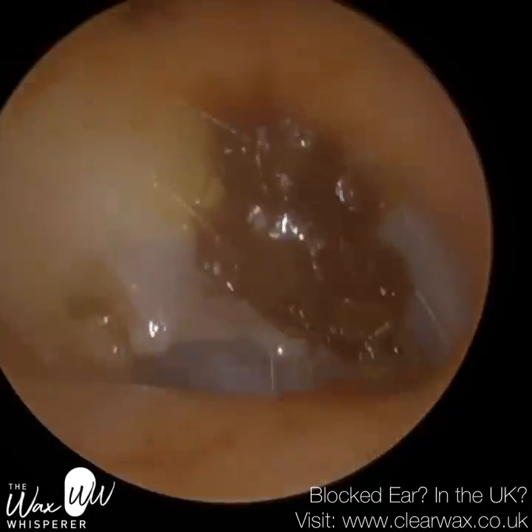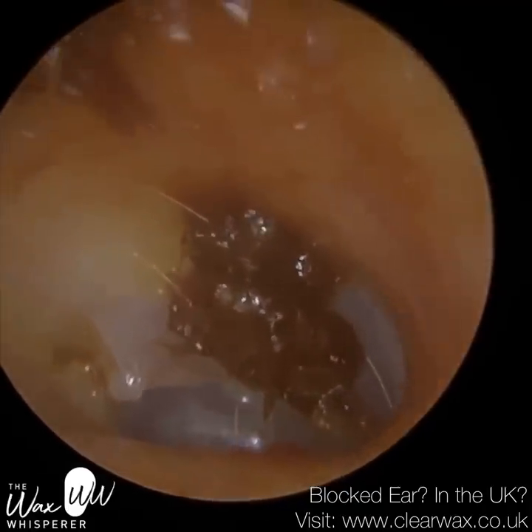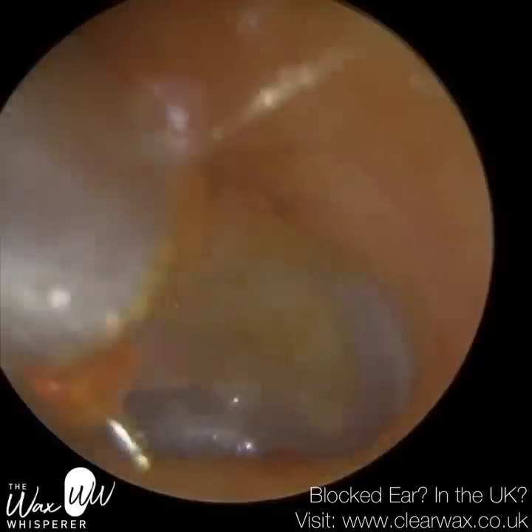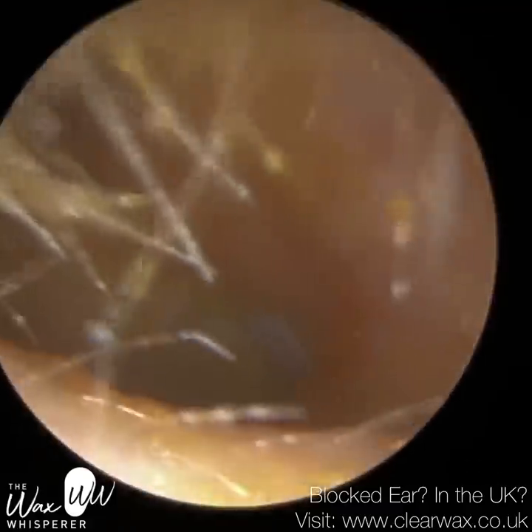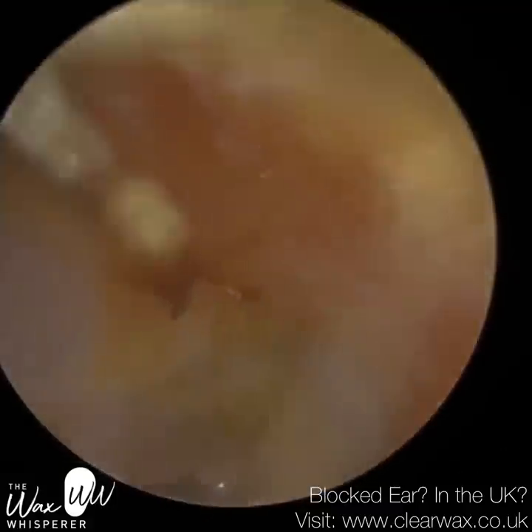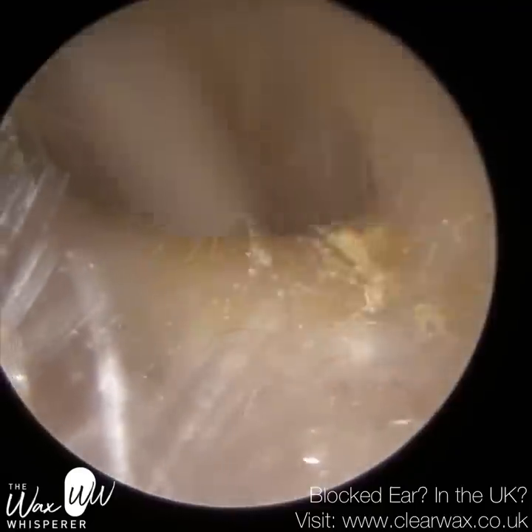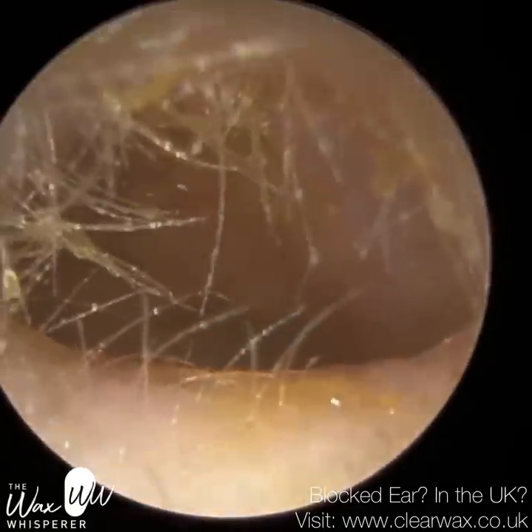The patient then used a cotton bud — it was like an act of desperation because they weren't able to hear — and it just pushed the wax plug further, unfortunately. Then they used some softening drops, and they said the softening drops made the impaction worse. And that can often be the case. Once you've got a substantial amount of earwax in your ear, using softening drops — whether oil-based ones or water-based ones like hydrogen peroxide or sodium bicarbonate drops — can exacerbate your symptoms because the wax plug can get larger.